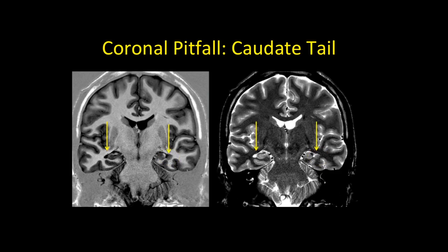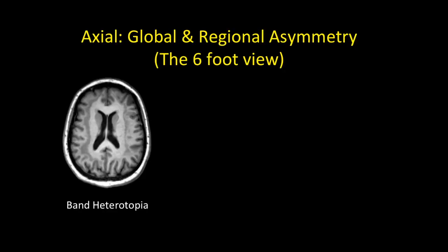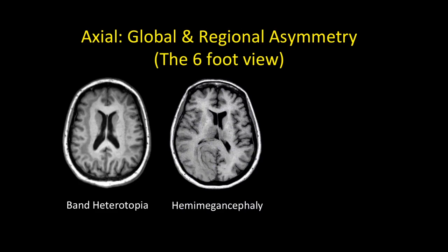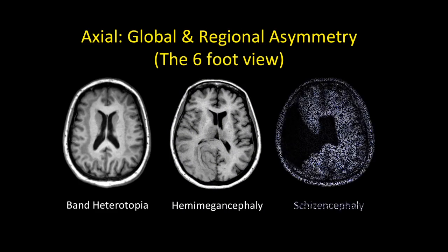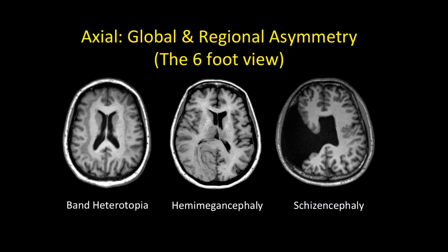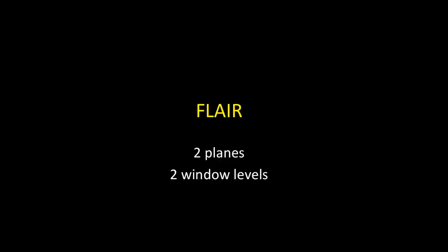On the axial MP-rage, take a step back and look at global and regional asymmetry — a six-foot view. Here's a case of band heterotopia, a case of right occipital hemimegalencephaly with accelerated myelination, and a case of schizencephaly. Look for right versus left comparison, anterior versus posterior comparison, and also look for second or even third lesions — as in this patient with schizencephaly who also has a missing septum, consistent with septo-optic dysplasia.